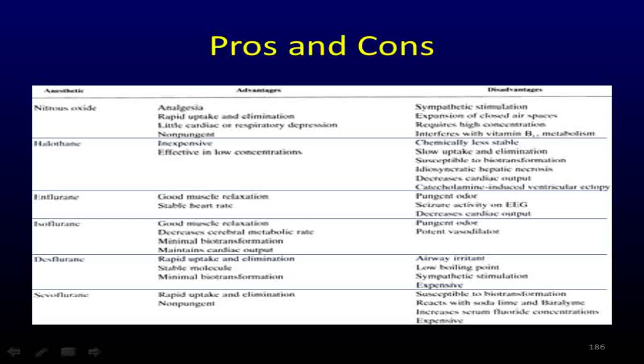So when you're at altitude, you actually end up giving more desflurane than you would at sea level. So that's how that special vaporizer affects it. I'm not going to test you on anything I just said. I'm only saying it because this is a question that will come up again in fundamentals.